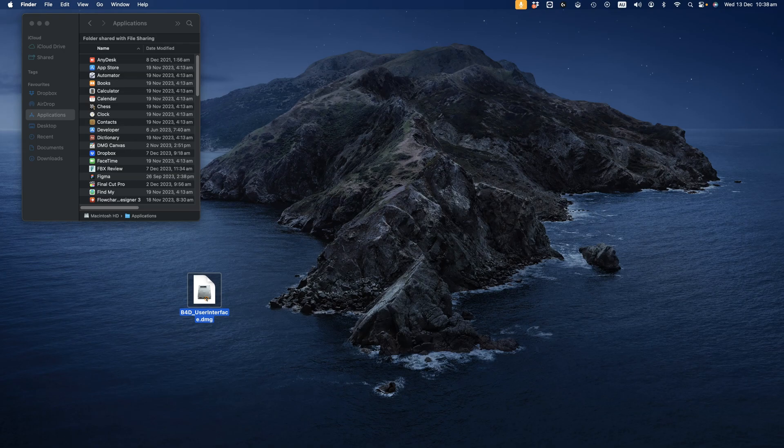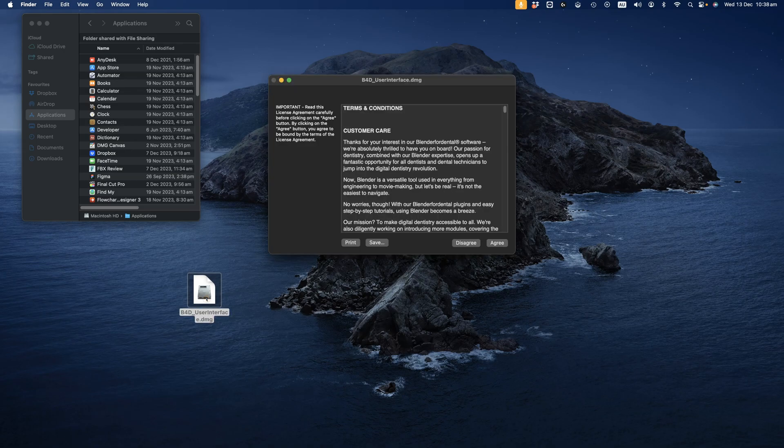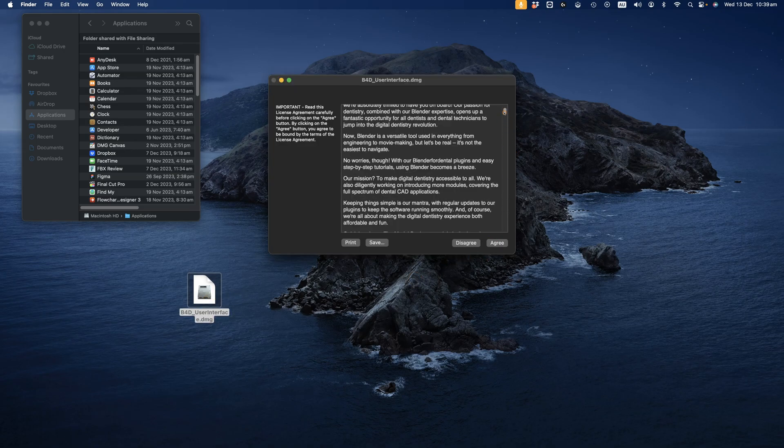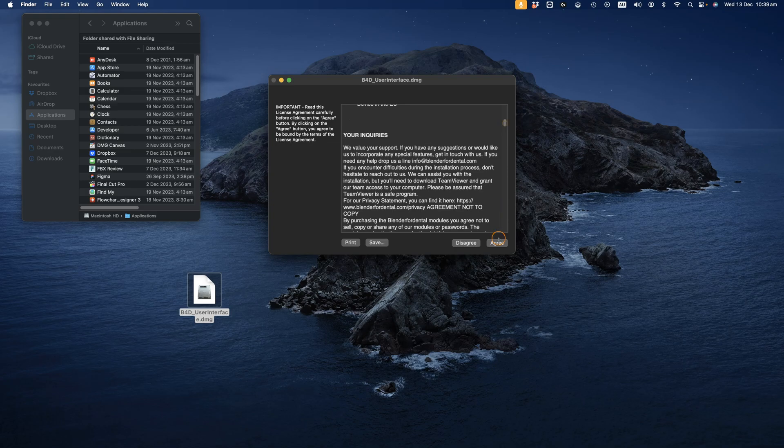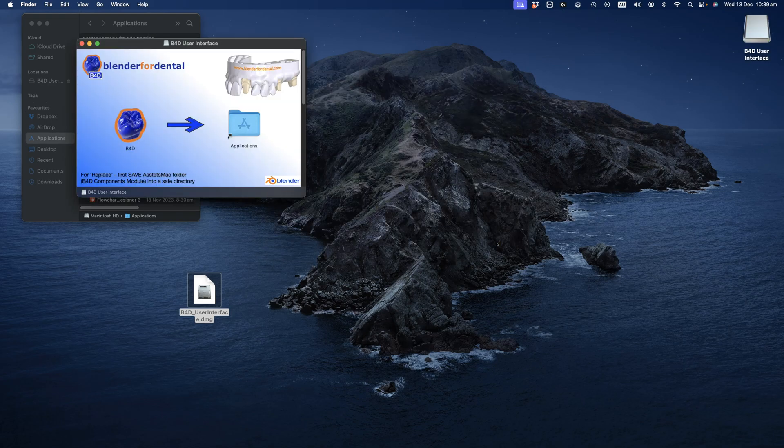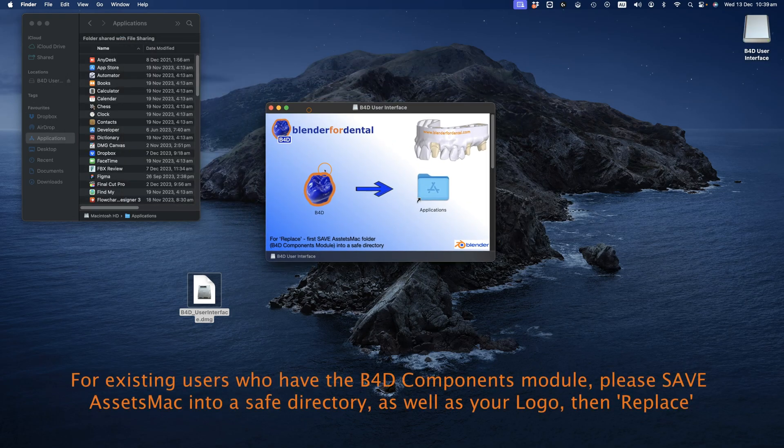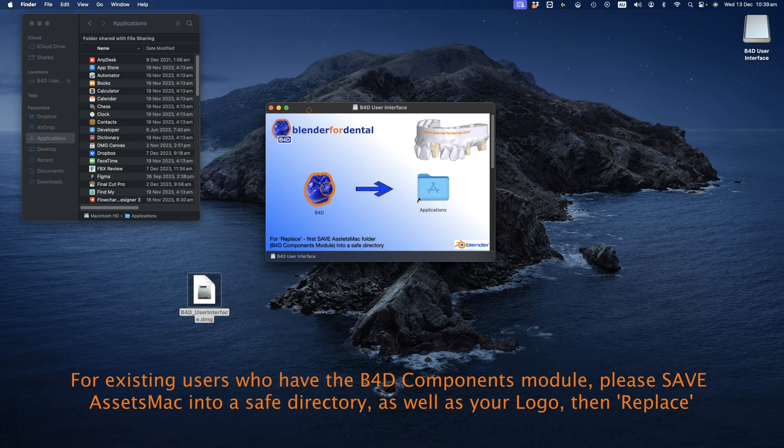Once the installer is on your desktop, run it. Review the terms and conditions and click Agree. Wait for the disk image to open, then drag the tooth icon into the Applications folder.